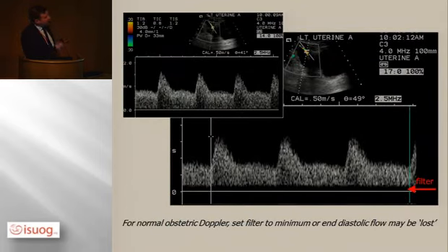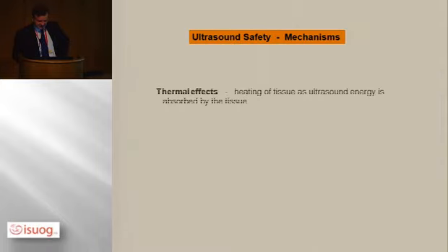Filter. In most obstetric settings, we just remove the filter completely. And the thing here is that if you have a filter on, you will remove part of the waveform, particularly if you're looking at umbilical artery end-diastolic flow, or you have quite a squashed waveform, a poor angle. If you then add a filter to it, you can lose half your waveform and make it uninterpretable. So generally speaking, we say take the filter off for your assessments. Slightly different in cardiac, but certainly for most obstetric settings.